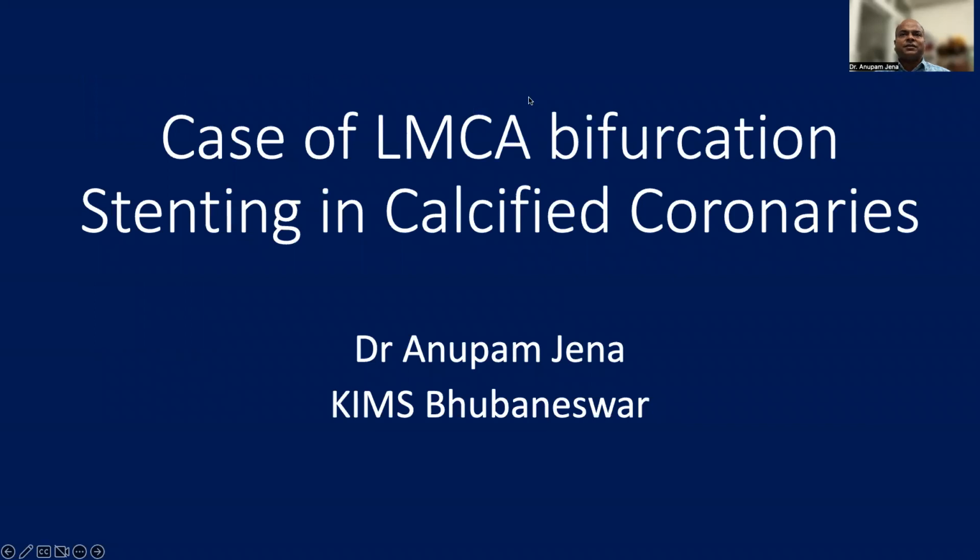So I'll present a case of left main bifurcation stenting in calcified coronaries. As we know, the spectrum of percutaneous coronary intervention is gradually widening and we are going into more and more complex cases. In that context, I would like to add that left main bifurcation stenting, even in the presence of severely calcified lesions, can be done. Of course, we have to learn some tips and tricks for doing that.